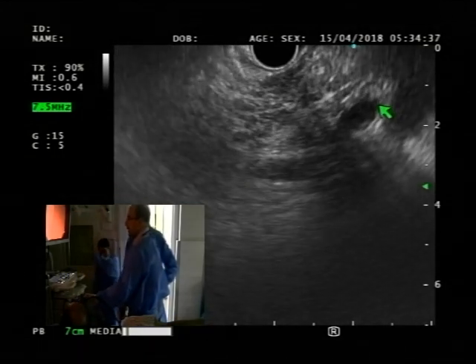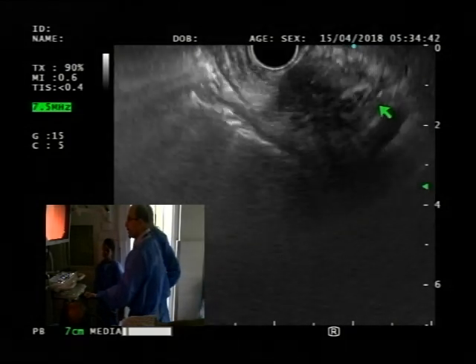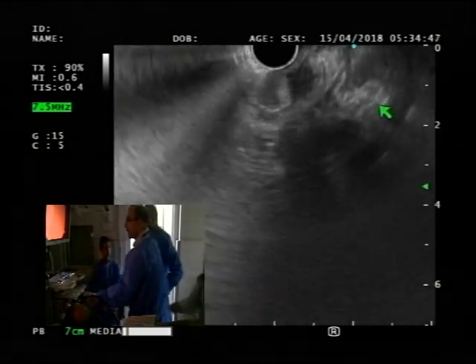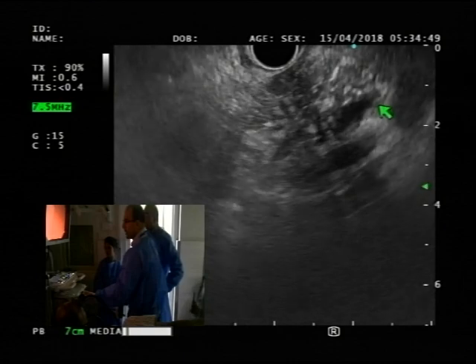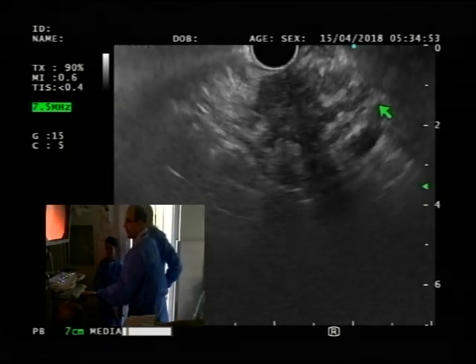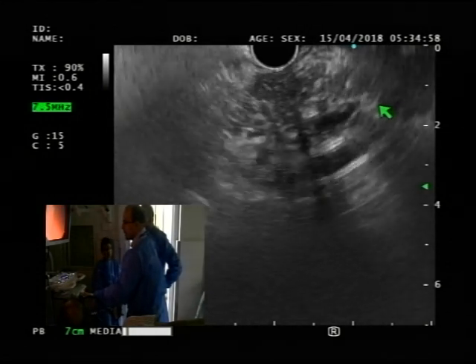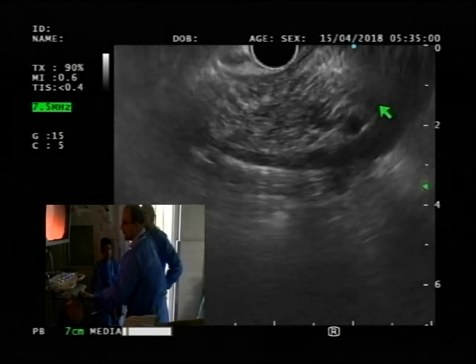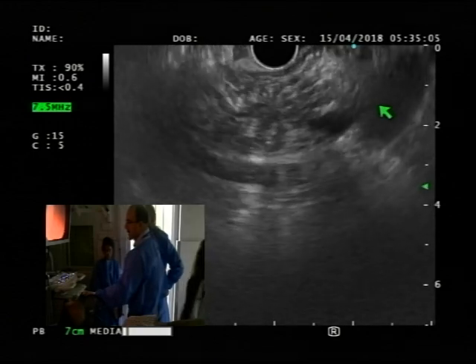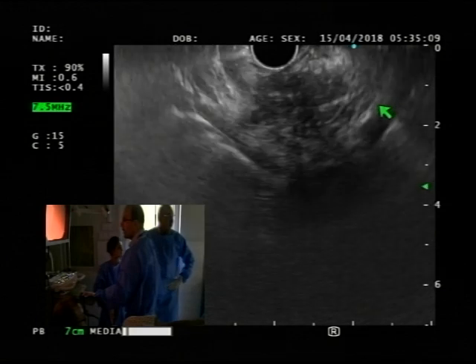Bile duct, pancreatic duct at the bottom. And now you can see the mesenteric vessels too for staging purposes. But again, it can be not so clear sometimes. Because there's your SMA at the bottom, and the SMV would be right behind the mass, except it's not very obvious to me. This is SMV, and this is SMA. And if you want cellular material, you want another one?